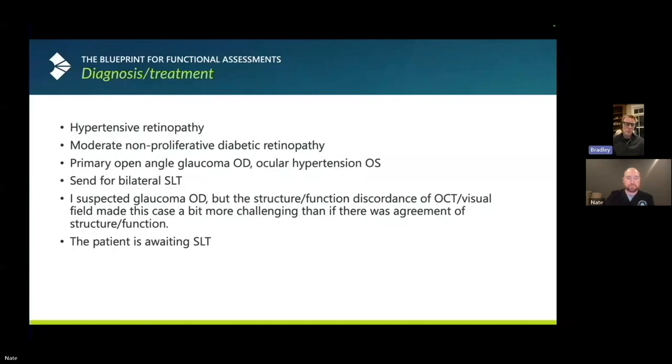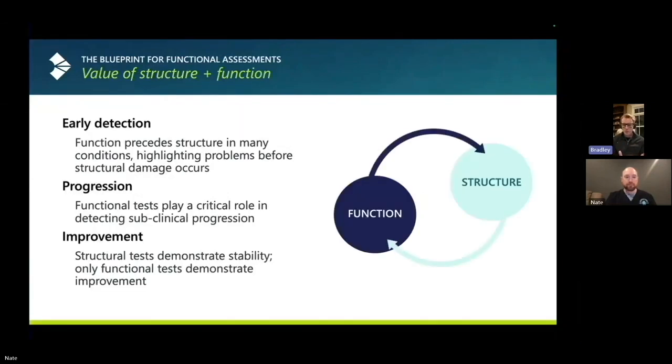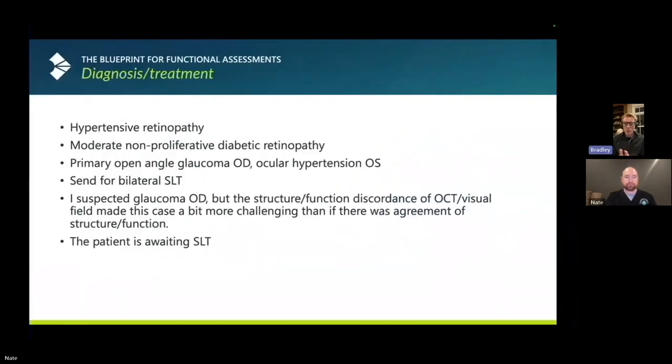And so this patient was referred for SLT. Again, we feel she's going to do fantastic. But in this case, many codes. Really, you could argue every single protocol could be run. She has diabetes, you could do the DR protocol. She has hypertensive retinopathy, you could do the flicker 16 protocol, and the PHNR gives us information. I'm most likely seeing this patient about every 4 months based on the glaucoma and the pressure, but I'm going to alternate those. I'm going to get a DR score every year, and I'm also going to get a PHNR score at least once a year so that I can watch those different sensitivity and specificity numbers based on her different levels of pathology.